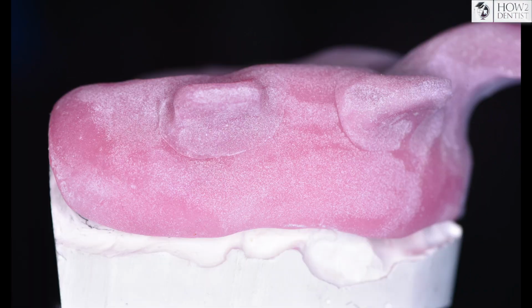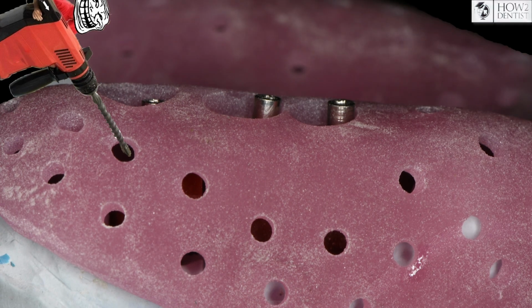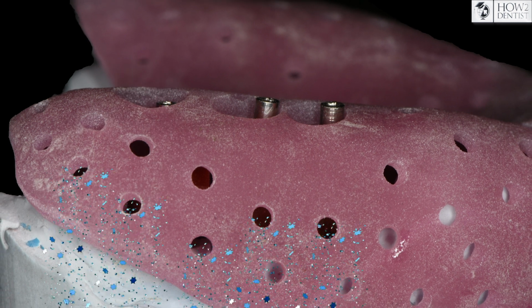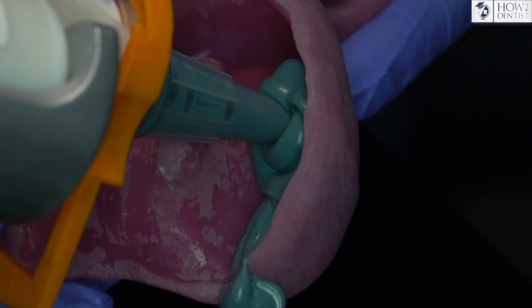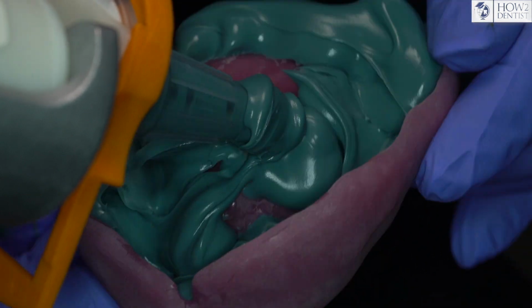If you use material for manual mixing, then you can make perforations. This will facilitate the insertion and position of the tray, since the holes facilitate the removal of excess mass and release pressure inside the tray, which will facilitate positioning. If the impression is obtained with automatically mixed mass, then the holes are not needed because the material is well pressed and does not interfere with the positioning of the tray.